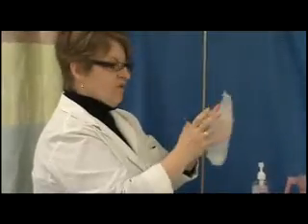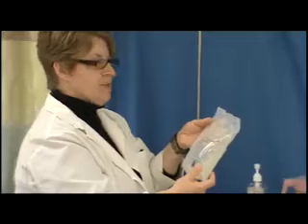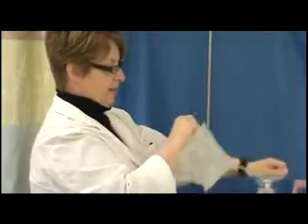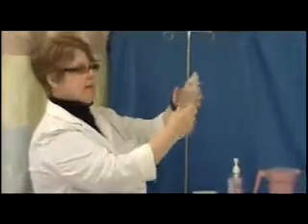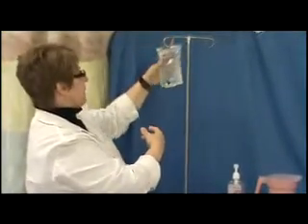If there were to be a lot of water in this bag, you would realize that this has probably got a hole in it. But this looks to be fine. So we're going to open it up, take it out, take another quick look at the light. I don't see any particles in there. And I'm going to hang it over here, getting it ready to be spiked and primed.